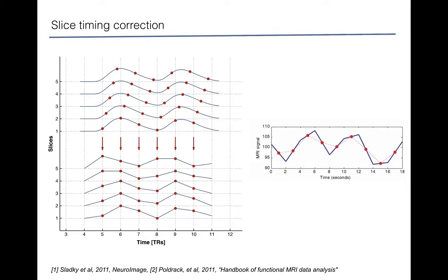But we are going to align it to a slice like the middle slice, which is collected at times 1, 3, 5, and so on. This figure shows linear interpolation, but there are other algorithms to do the interpolation. Basically, you can use sinc, spline, or other algorithms.